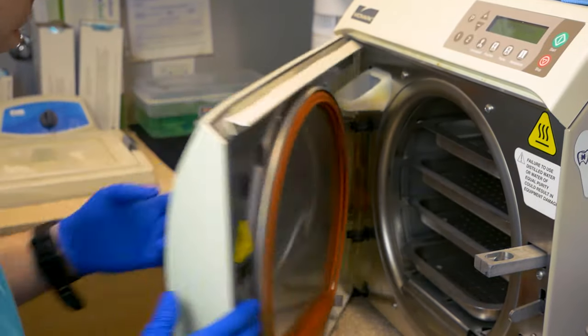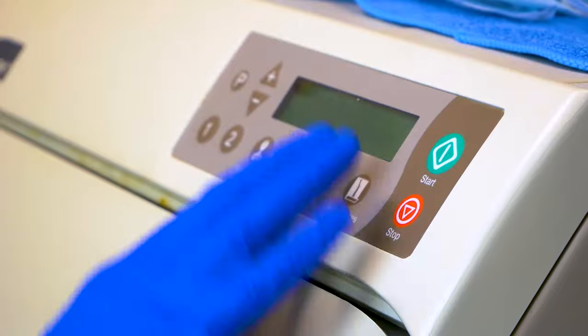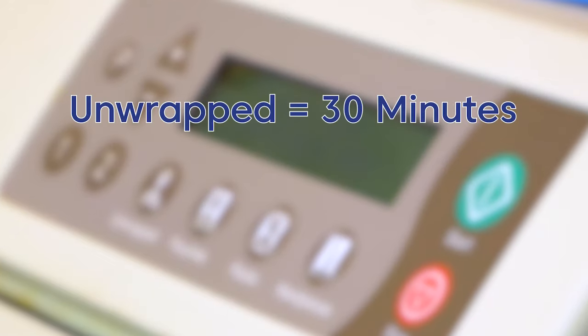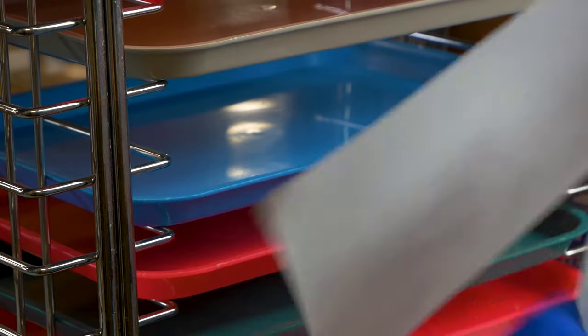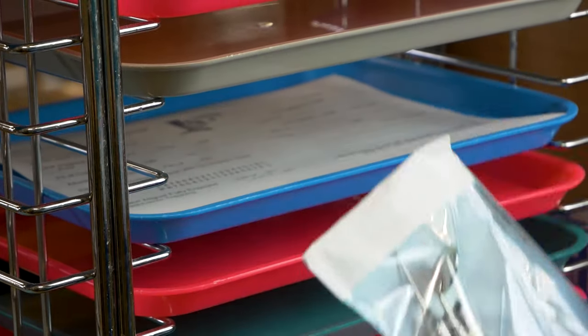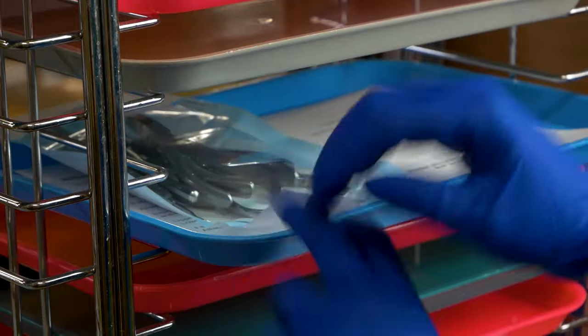If the instruments are unwrapped, meaning not in a pouch, they will sit in the autoclave for 30 minutes. Pouches will sit in the autoclave for 40 minutes. Once the instruments have been completely sterilized, the sterile tech will either organize them in a drawer or a tray. The tray will be placed on a rack for an assistant to take and use for a patient.